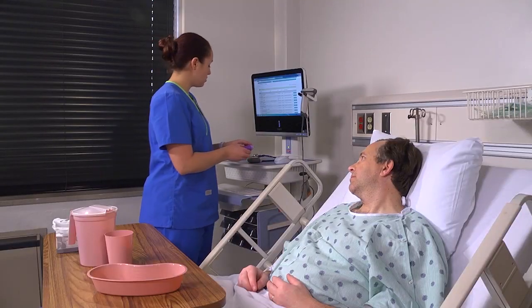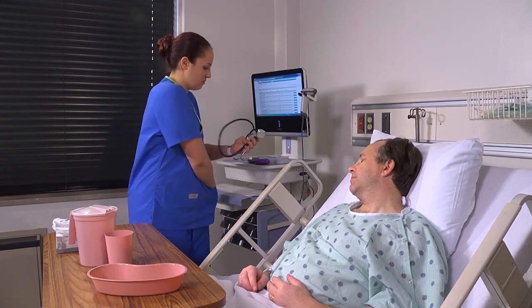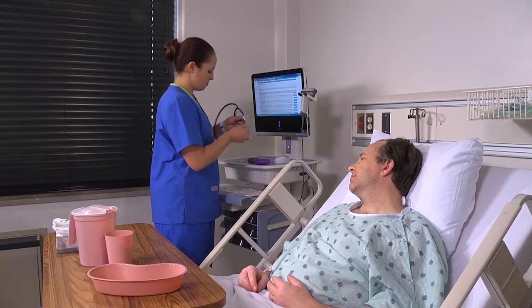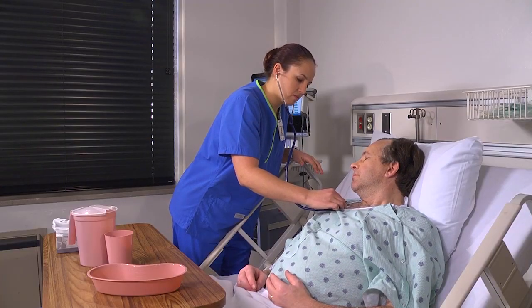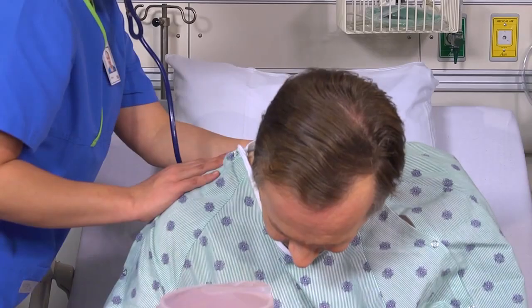Okay, first thing I'm going to do is take a listen to your lungs before we do the inhaler, okay? Okay. Just take some nice, slow, deep breaths for me, okay? Assess the patient's respirations and breath sounds. Ask him about his subjective symptoms, such as shortness of breath.